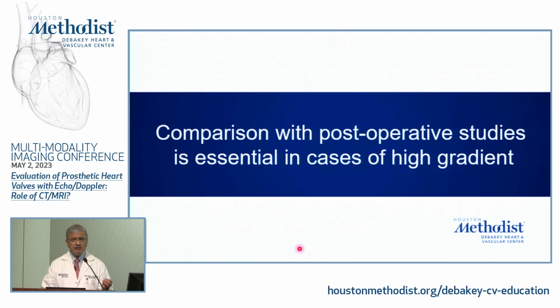Why? Because each individual, it's almost like the fingerprint of that particular individual, particular valve in that body. And I think it's important because the LV outflow tract may be a little different, ejection properties may be different. There are so many other things, and technically it may be different. So it's important to do that and then go back. Nowadays with digital technology, hopefully you can see the previous studies and compare whether there is a change.